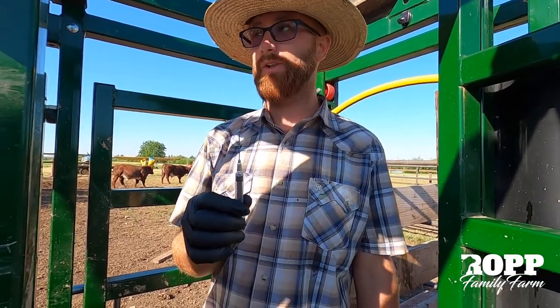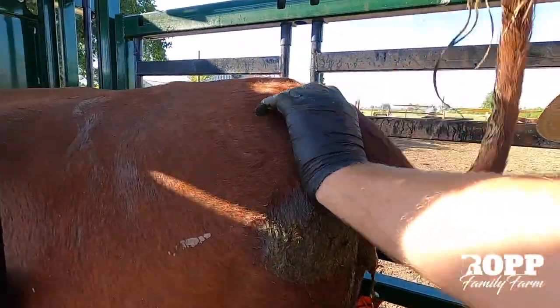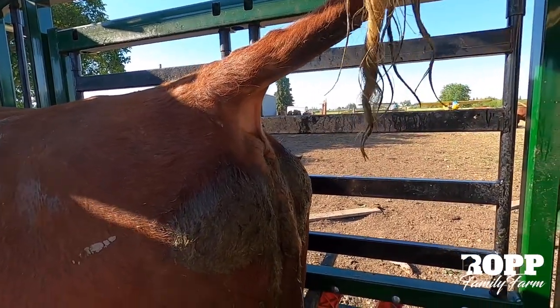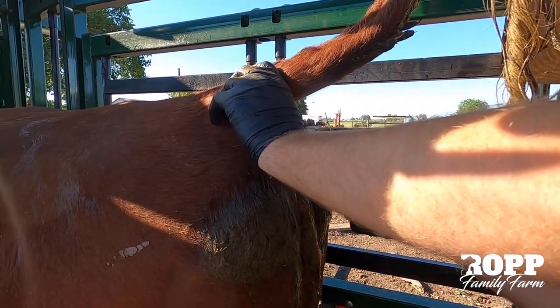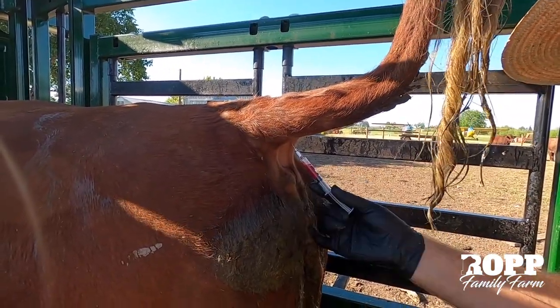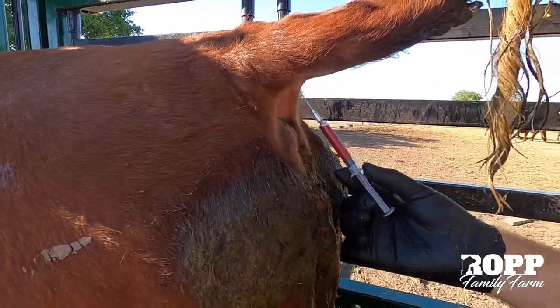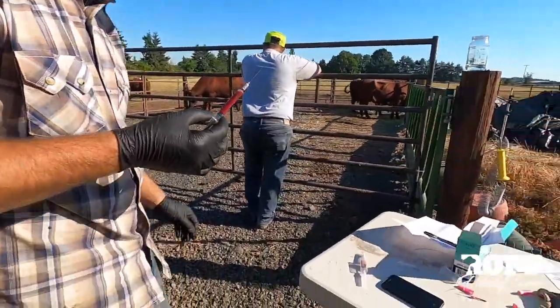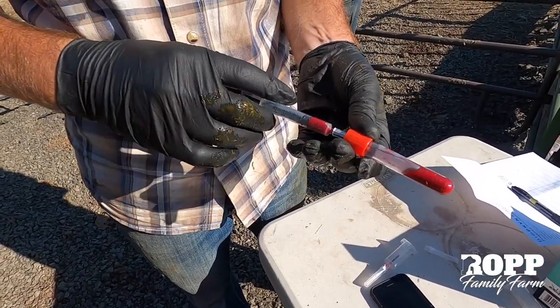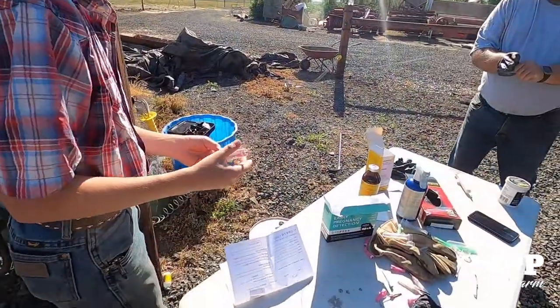You can always do it the old-fashioned way with a needle — a good heavy gauge needle and a syringe. You're going to do the same thing: find that same spot, hold the tail up tight, clean the area off. Go in, pull back, and you get a good blood draw. Since we're doing this, we'll go right over here, take our vacuum tube, and go ahead and fill that up. Isaiah will finish that up and we'll go on to the next cow.